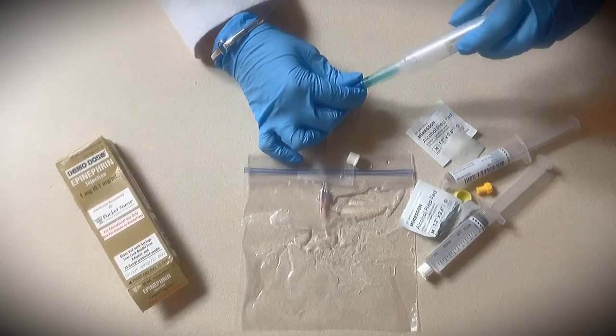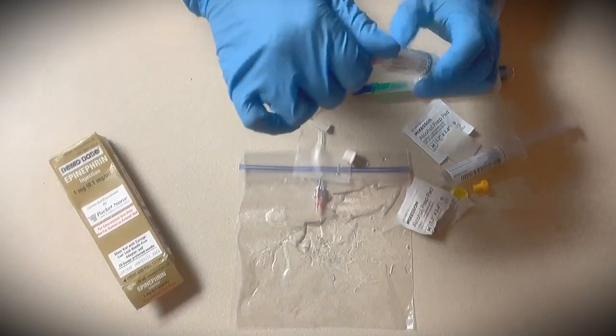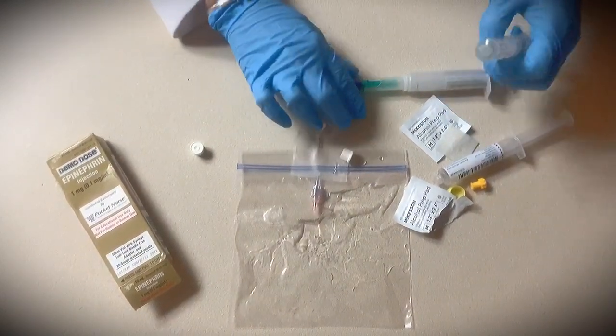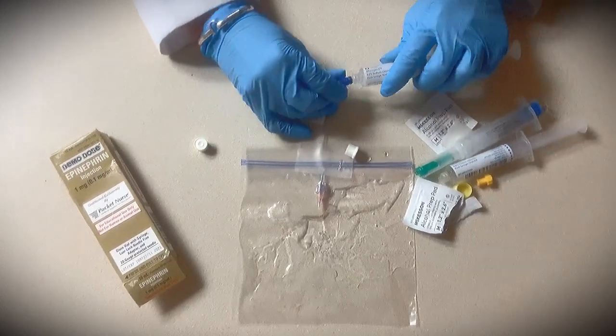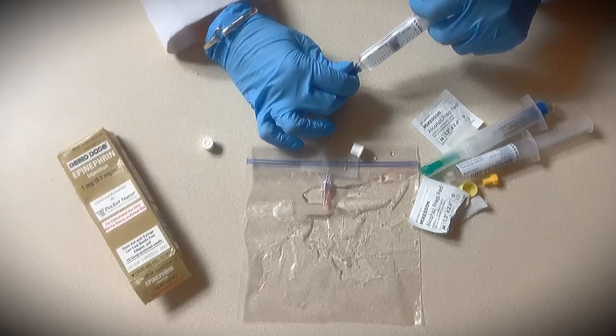Notify everyone on the team and the recorder that your epinephrine has been administered. Pick up your second saline flush, get rid of the excess air, remove the epinephrine, and give your flush — at least five mLs of it.